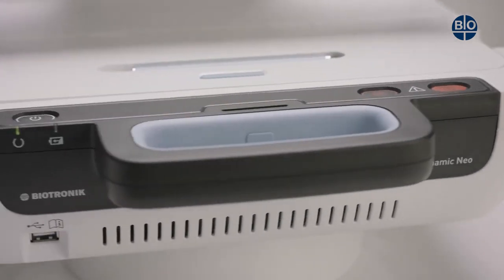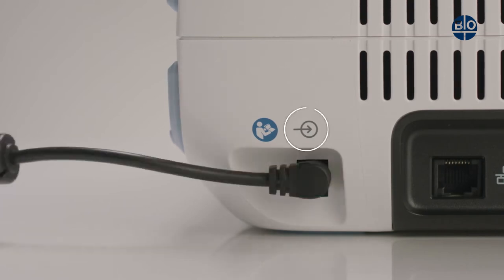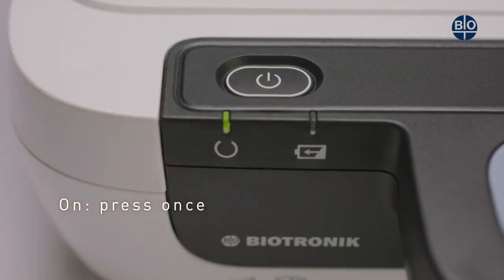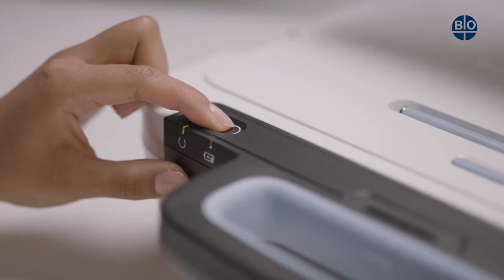The power plug for the device can be found on the rear of the left side panel and is illustrated with this symbol. To turn the device on, press the power button on the front left part of the top panel once. To turn the device off, hold the power button down for two to six seconds.